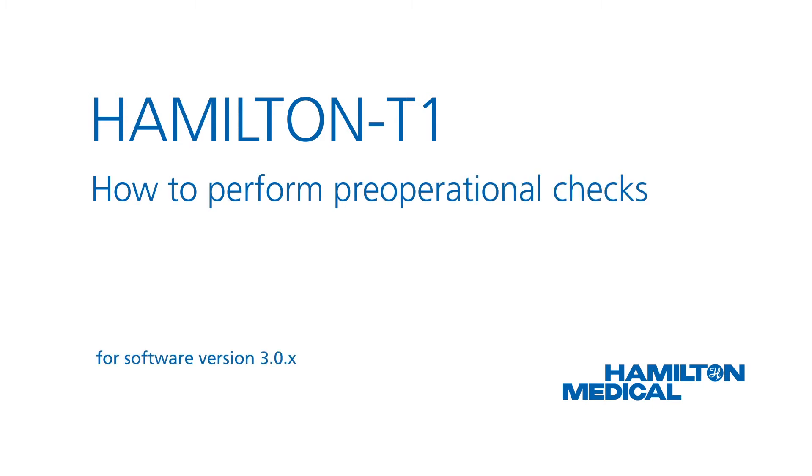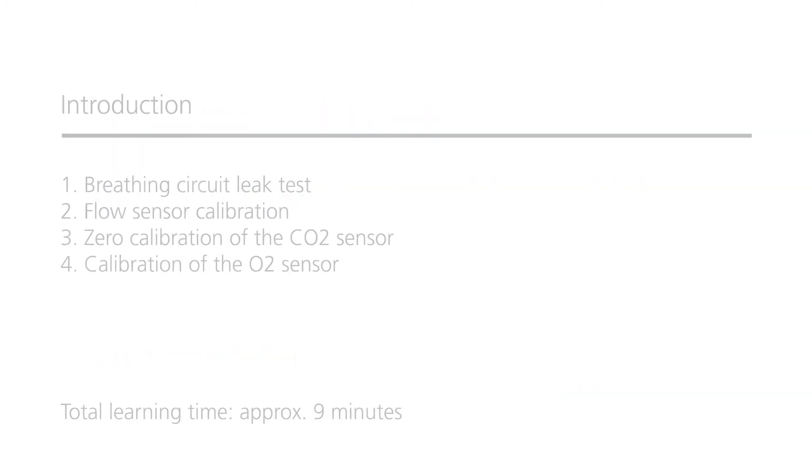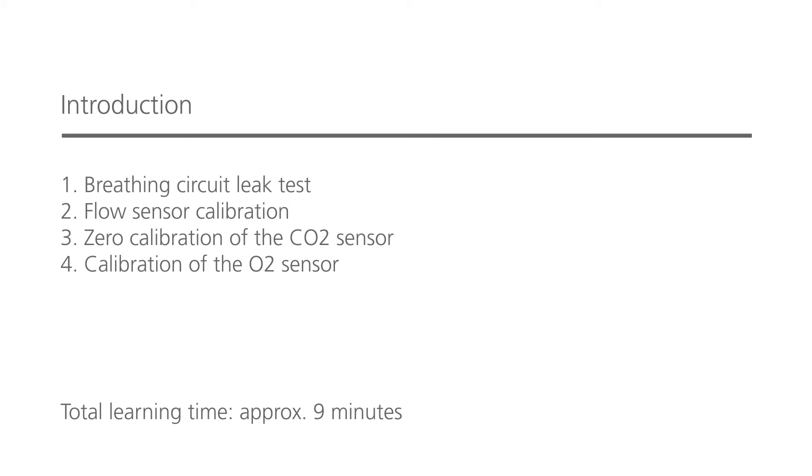This how-to video will show you how to perform the pre-operational checks, including calibration of the flow sensor and a breathing circuit leak test. You'll also learn how to calibrate the O2 sensor and zero calibrate the CO2 sensor if this option is available. Make sure you always do the pre-operational checks before connecting a new patient to the ventilator and after you've connected a new breathing circuit or any other new component. You should be able to complete this whole module in less than 9 minutes.